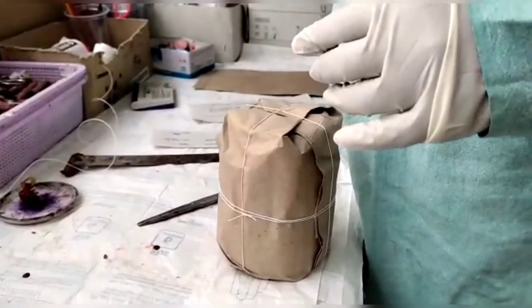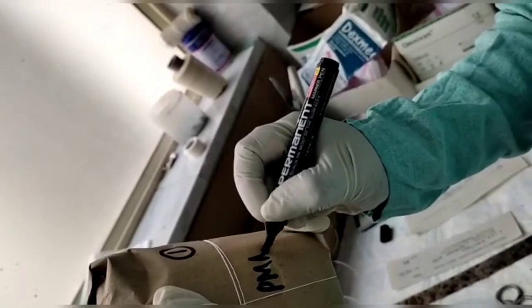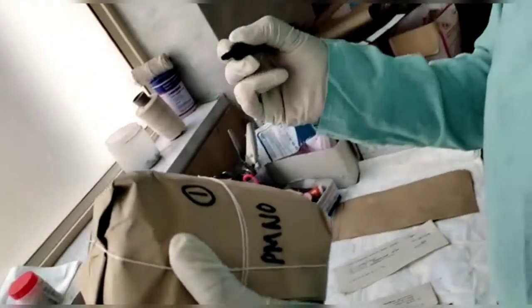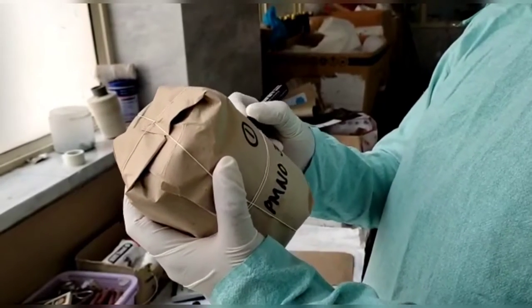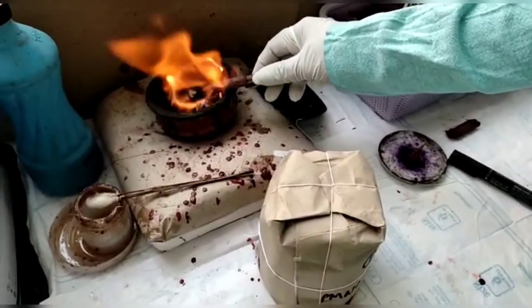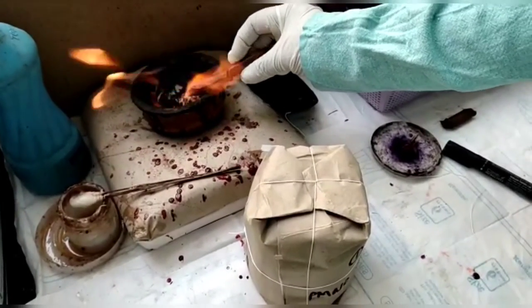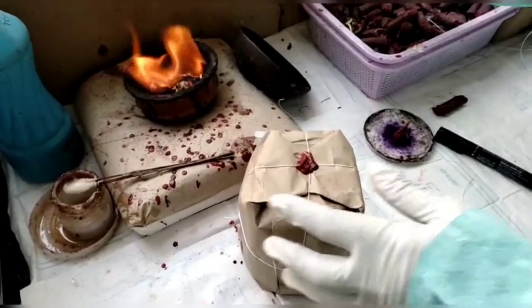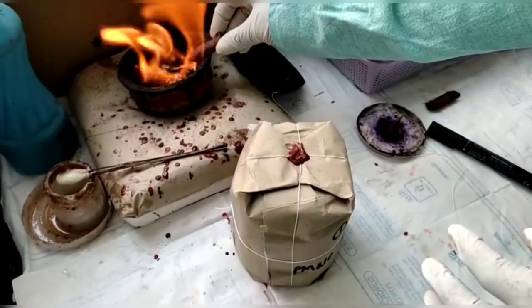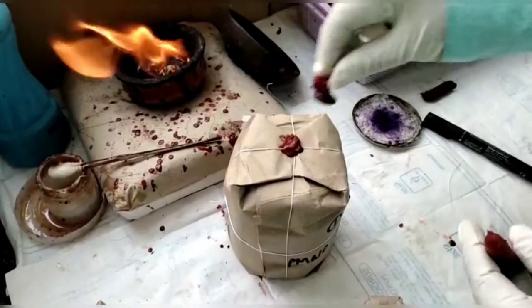After the Viscera bottle is tied, the postmortem number of the Viscera is also written on the outside of the packed Viscera bottle. Now we can see that the packed Viscera bottle is sealed using wax. For wax sealing, a metal seal is also used.